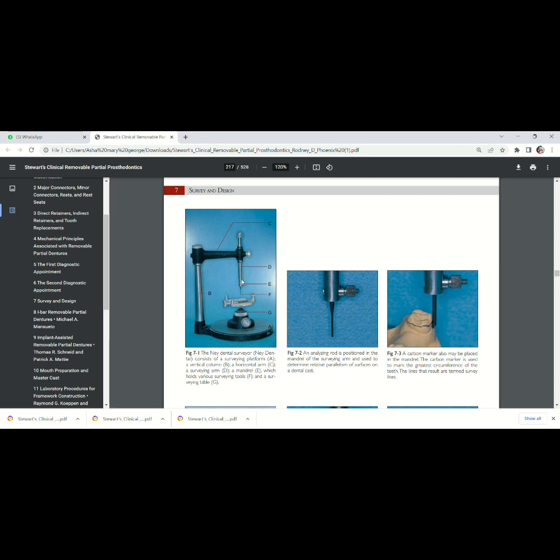And here we can attach different surveying tools. I will discuss each and every surveying tool. Here we are supposed to place the surveying tools. This part is enlarged over here.